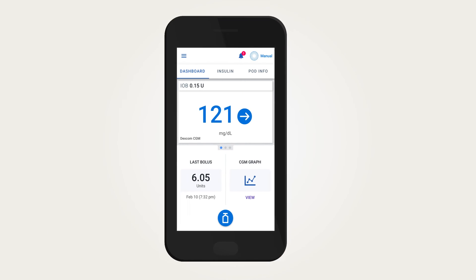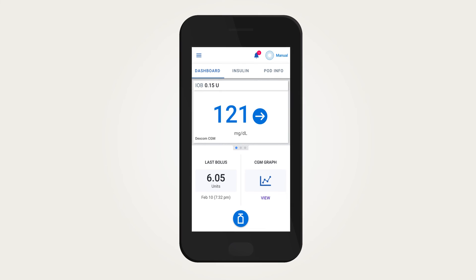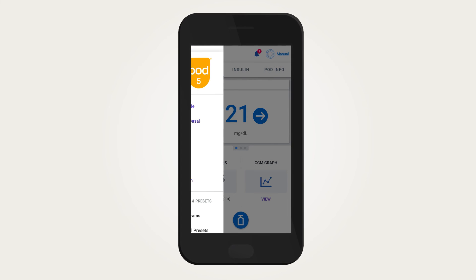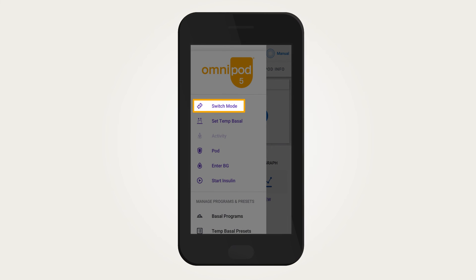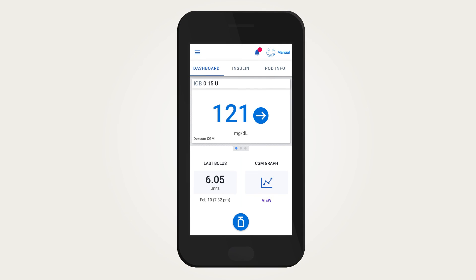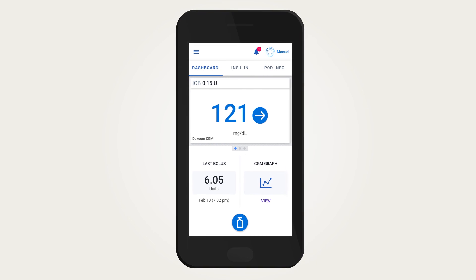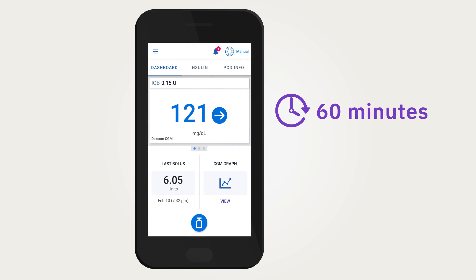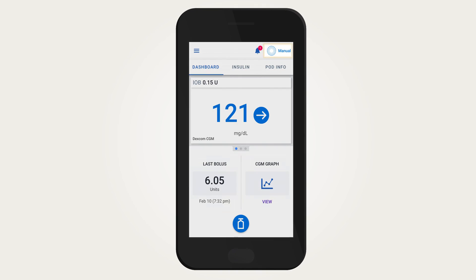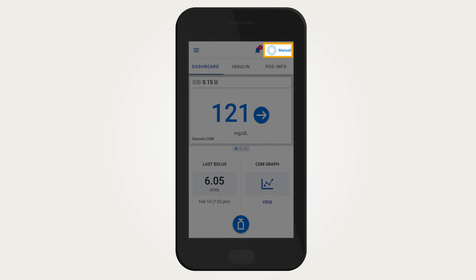To switch to automated mode, you will need to have an active pod and a valid Dexcom G6 transmitter serial number saved in your Omnipod 5 app. From the menu button, you can simply switch from one mode to the other. Once the pod starts receiving sensor values, automated insulin delivery will increase, decrease, or pause based on these sensor values and where they are predicted to be in 60 minutes. You can check what mode you are in by looking at the mode indicator on the upper right-hand side of the home screen.